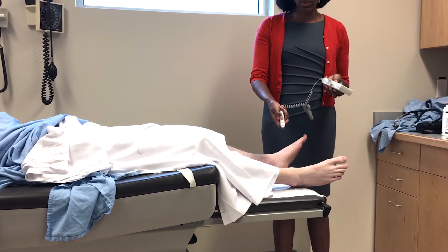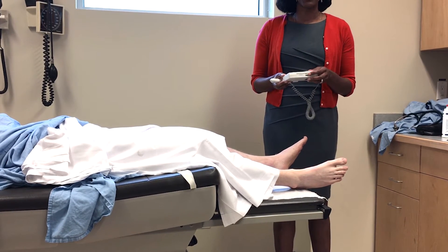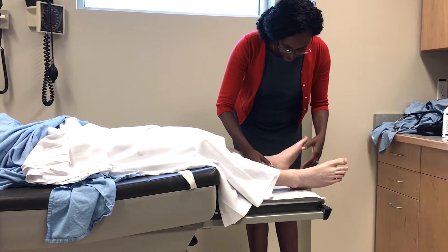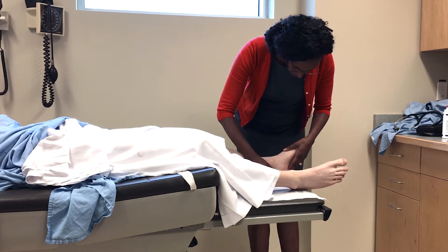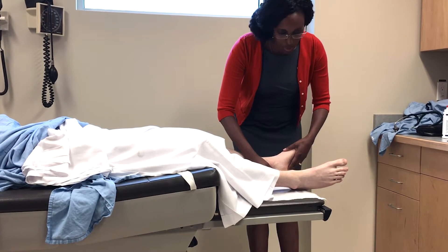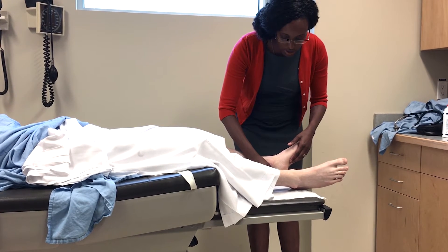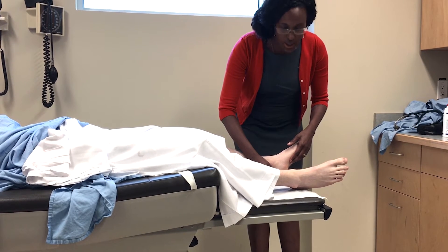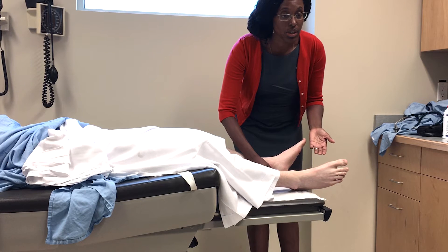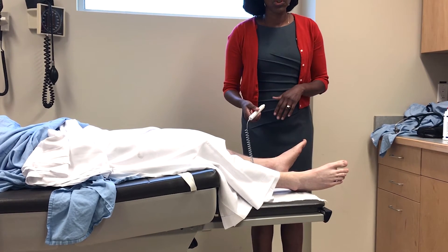To start the doppler, most have a power button and also a volume button. If you hit the power button and don't hear anything, most commonly it's the volume that's not up. You typically want to be 60 degrees from the pulse to have the best signal. It's important to move the doppler around the limb until you are confident that you are feeling the pulse at its loudest portion. You're listening for the presence of the pulse, the way in which the pulse falls, the frequency — for example, is there atrial fibrillation — and its presence. The same thing is repeated for the dorsalis pedis.